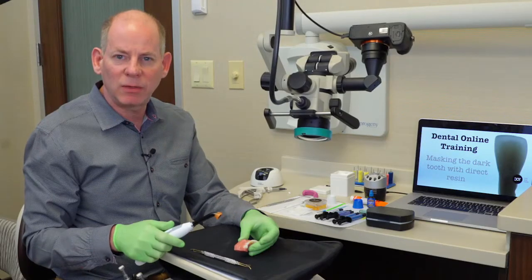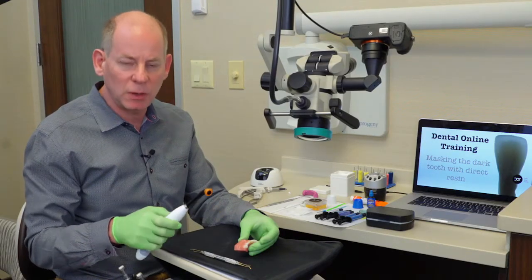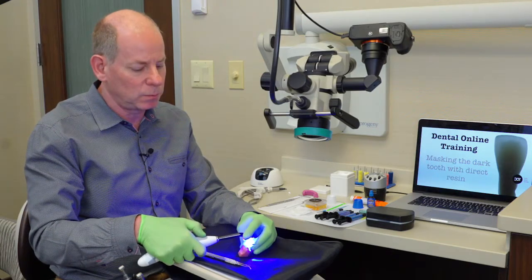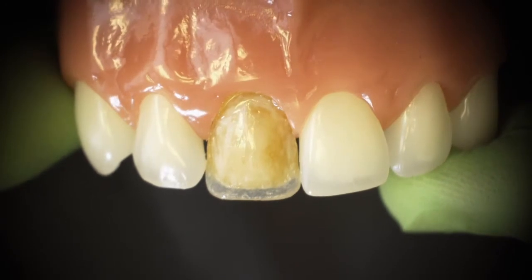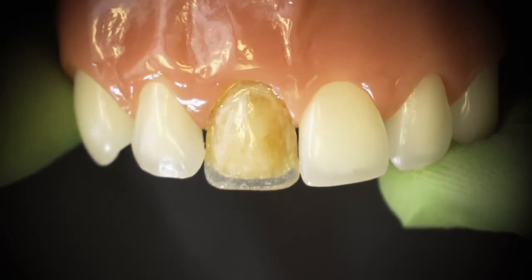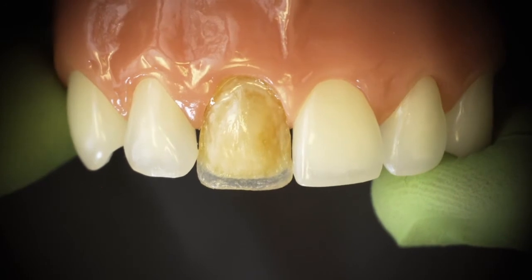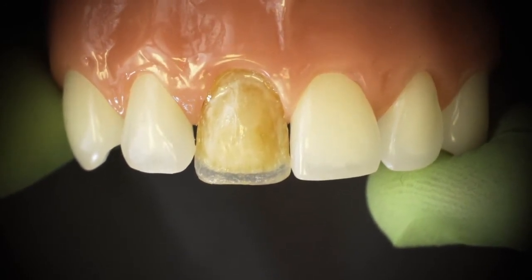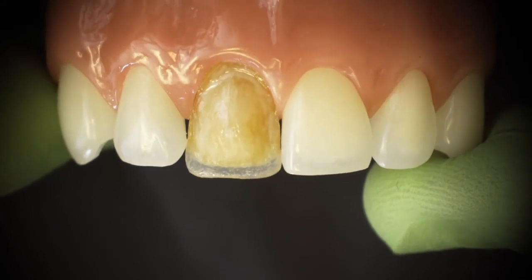Now that I have the WTI nano in place, I'm going to light cure that for 10 seconds. As we look through the scope, you can see the translucency with this WTI. That's going to really allow us to create the same translucent effect that we're seeing in the neighboring tooth.